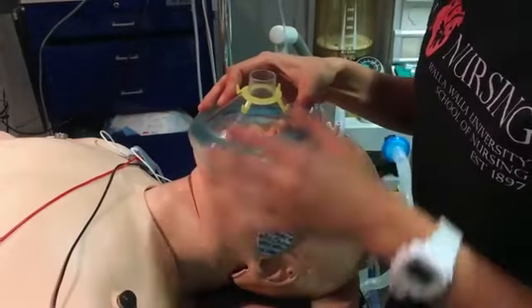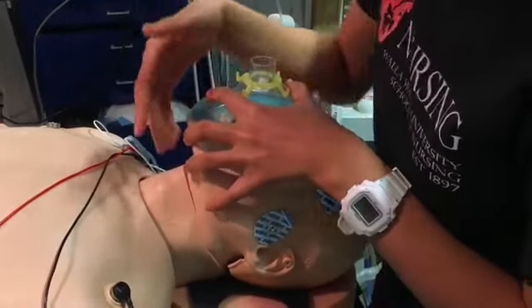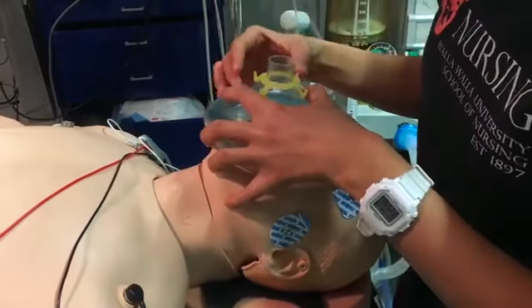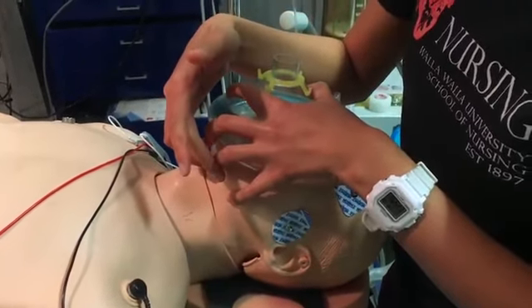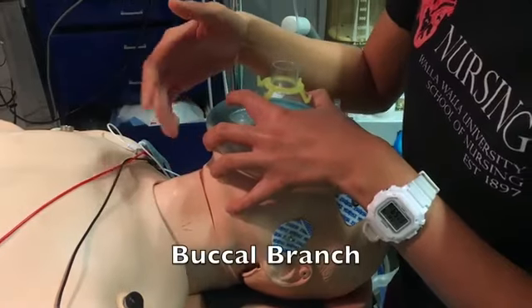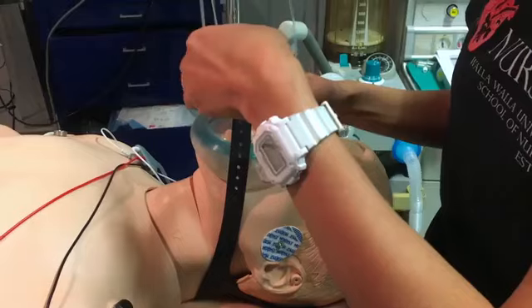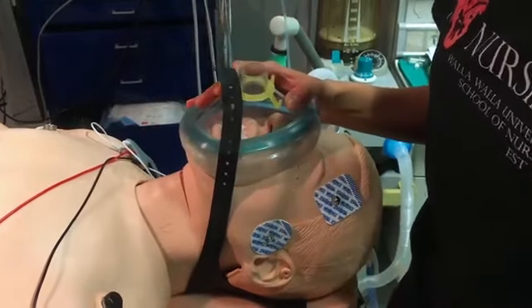If you push too hard during the face mask, part of the facial nerve can be damaged. The buccal branch of the facial nerve can be damaged. There are these things called face straps, which are kind of nice.